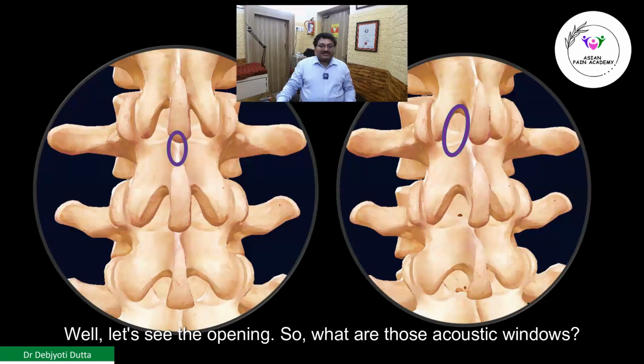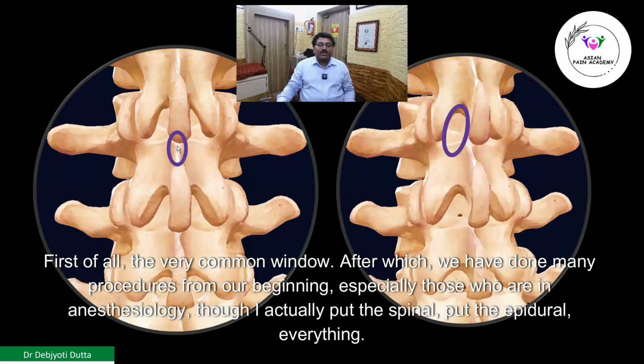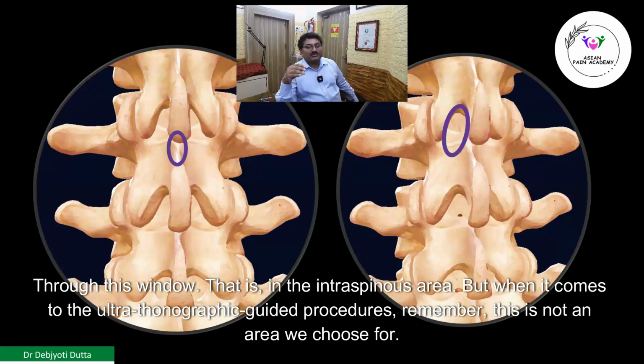Now let's see the openings. So what are those acoustic windows? First of all, the very common window through which we have done many procedures from our beginning, especially those who are in anesthesiology. They put the spinal, put the epidural, everything through this window. That is in the interspinous area.